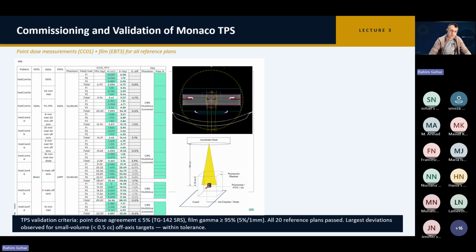If you compare the ion chamber measurements with your TPS doses, the differences are very, very minimal. And that difference, as I mentioned, can get worse if your PTV sizes are smaller and smaller. From there, you can determine at what point your model fails. From there, you need to put a lower limit: we have validated these plans up to this much. Below that, you can't really use it.